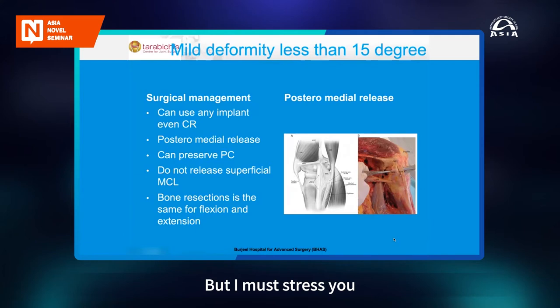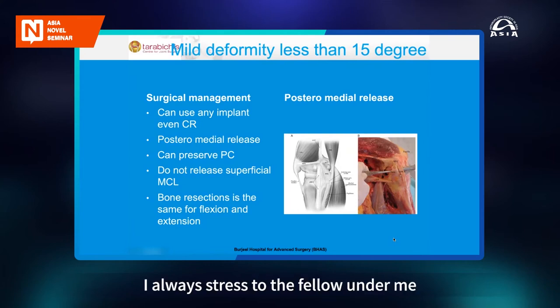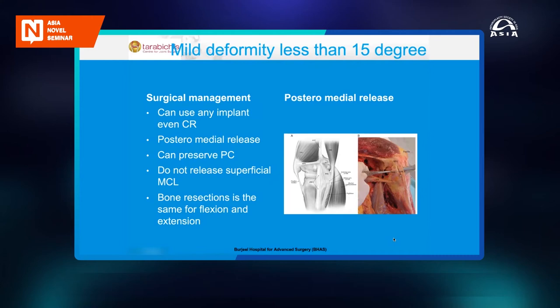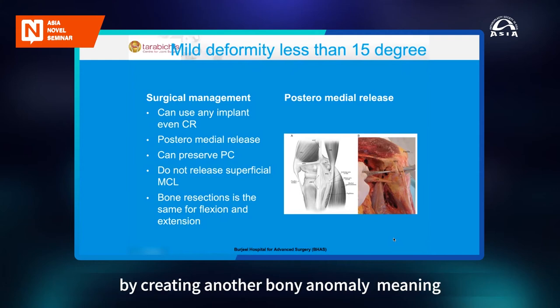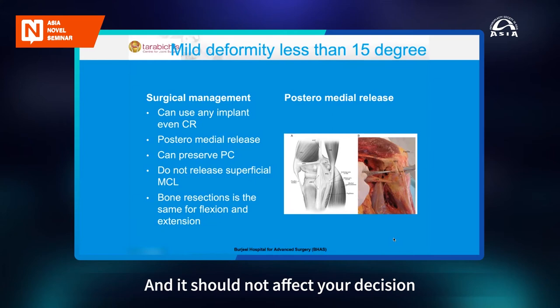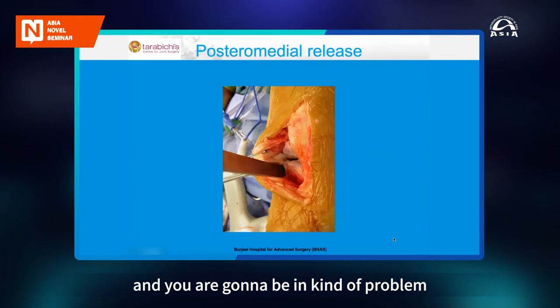But I must stress, please don't release your superficial MCL. Because the minute you do that, the knee is going to be unstable and you're going to require a constrained implant. And I always stress to the fellows under me, don't try to correct a soft tissue anomaly with bone by creating another bony anomaly. Meaning your flexion extension gap should be balanced, and the flexion contracture should not affect your decision on how to balance the gap. In another word, don't do a lot of recut on the distal femur, because you're going to change the joint line and you're going to be in a problem.